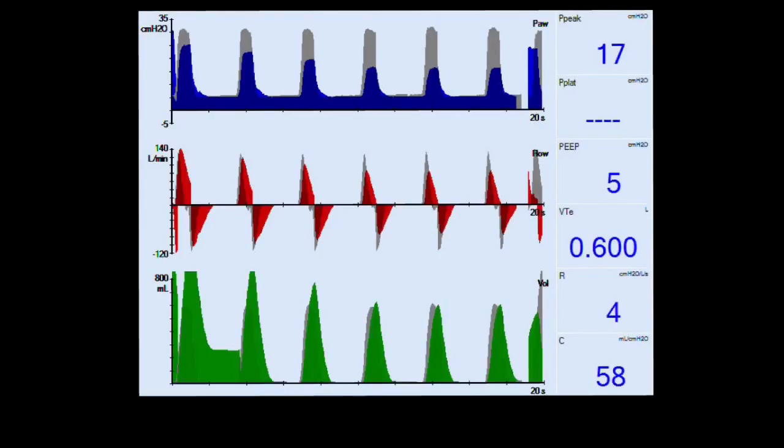So I changed the settings on the test lung, and I made the compliance a lot better, almost doubled the compliance. And this is a frozen screenshot showing the progression of the ventilator between each breath. It's changing my pressure control level. And we're going to look at my pressure waveform here. As you notice, with every breath, it's decreasing my pressure control level. So it's titrating my pressure control by each breath to achieve the target value of 600.